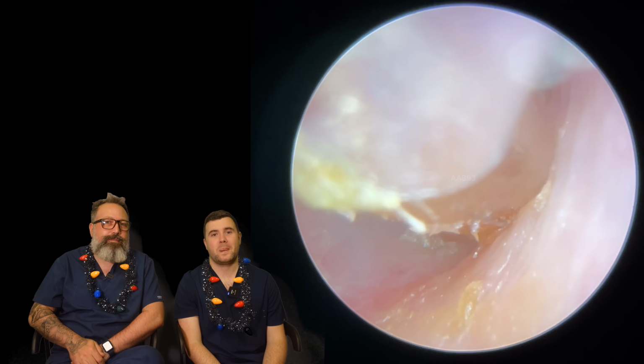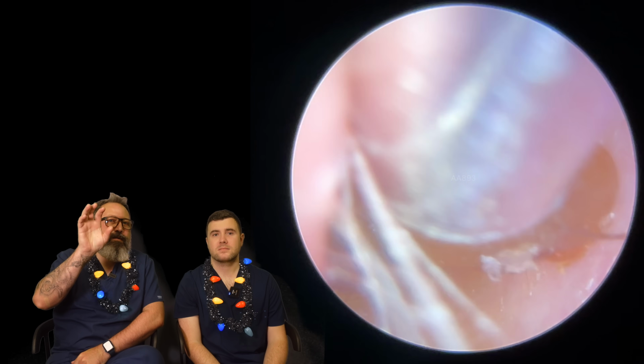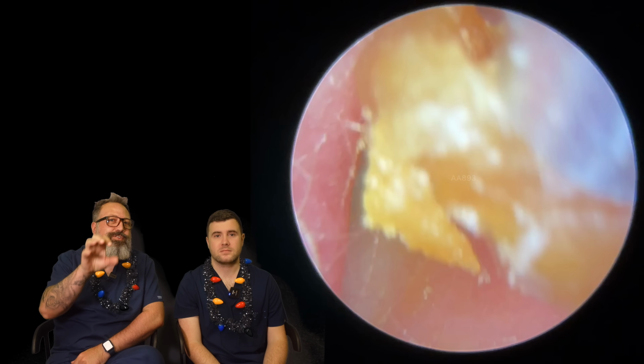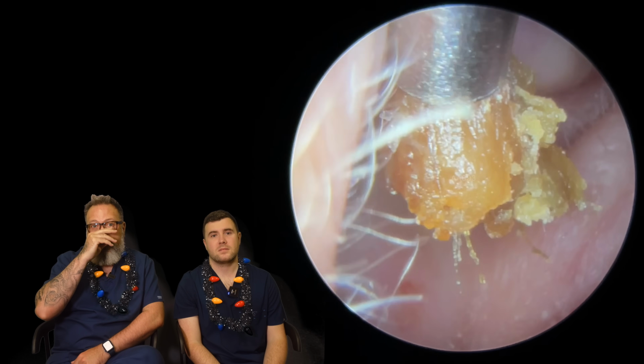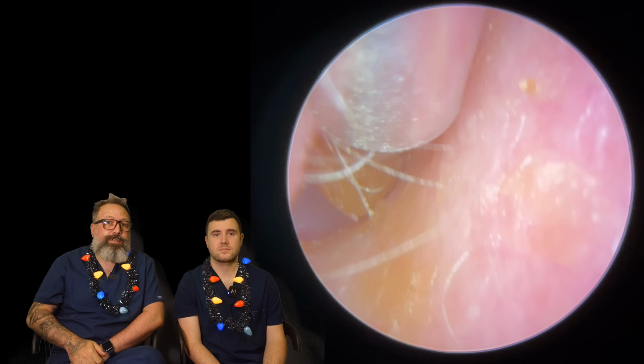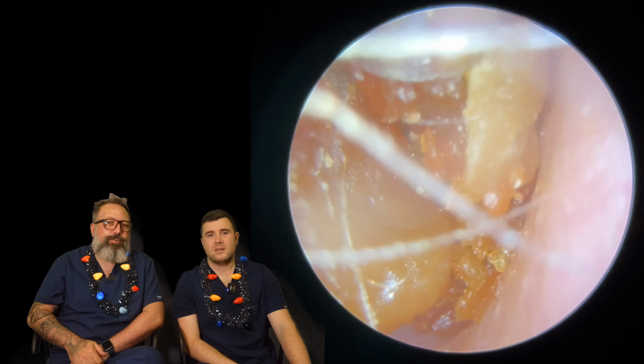This is my patient, very impacted. Oh, I remember this patient now. Very sort of impacted wax. I was about to say deep, but it's not deep because I think this patient has a false fundus. So let's take a look. Beyond that, I'm pretty sure this is the one. If not, we'll just stop it and I'll go back and revoice it over.